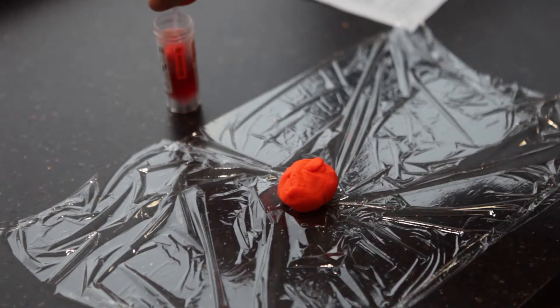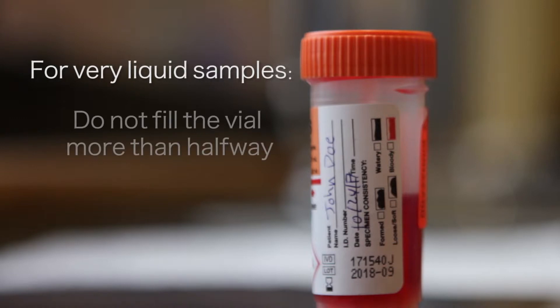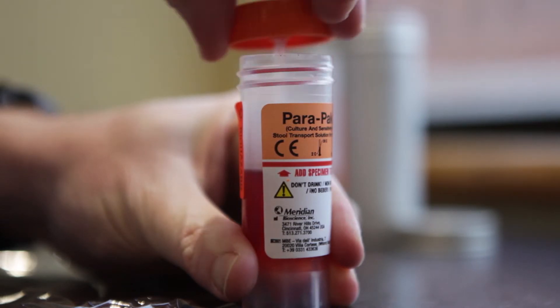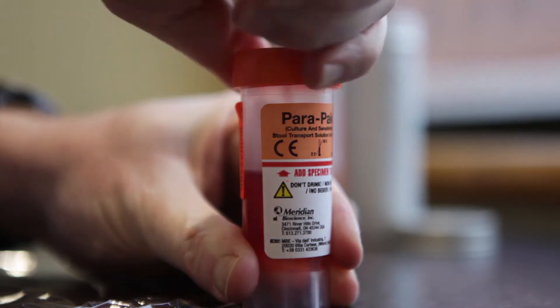For very liquid samples, don't fill the vial more than halfway or overfill it. Use the spork to mix the sample with the red liquid in the vial. Then screw the cap on tightly.